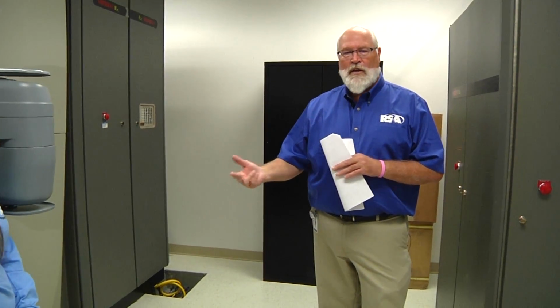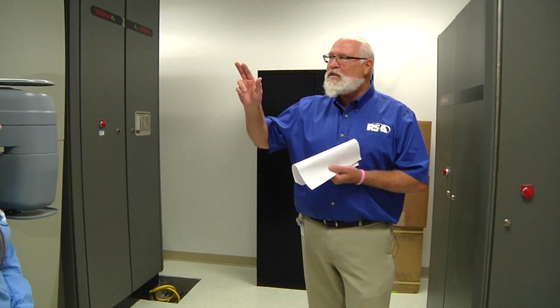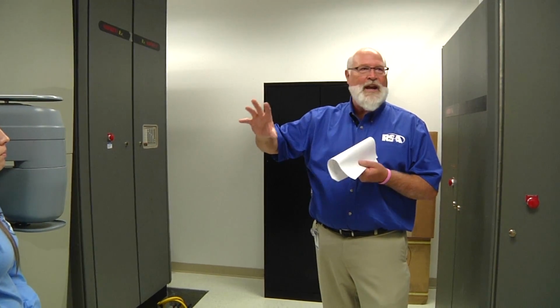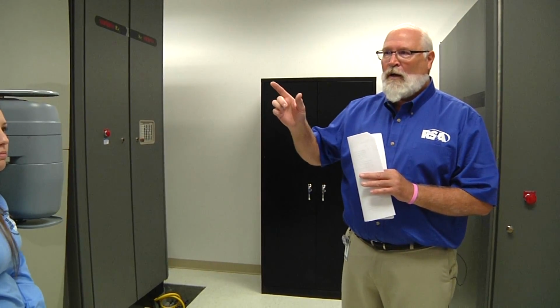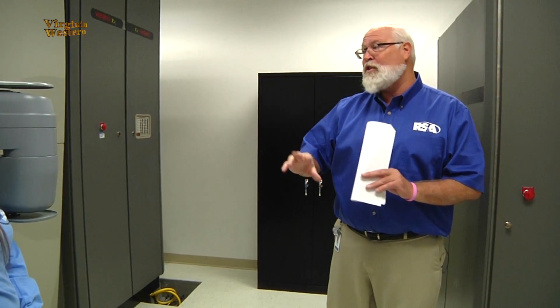You rotate the collimator to 90 degrees if you have an MLC, a multi-leaf collimator. And that's so you don't have the gravity of the leaves pulling against each other. So you have it in a static position. That's why you rotate the collimator to 90. If you have just a system with a portal vision, we'll ask you to rotate to just 90 degrees because we don't have the issues with the OBI tube in that. If you don't have any of those components, some people just park the gantry down at the bottom. So that's why the gantry is parked in these positions. Sometimes we may forget, or you're in a hurry, or there's a service need why we need the gantry parked head up. And we'll leave you a note. Say, don't rotate the gantry, don't do this, we're still working on it, your machine's down half a day, or whatever. So let's go around to the other side.